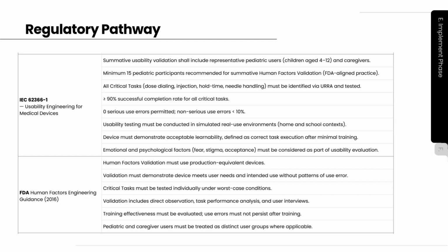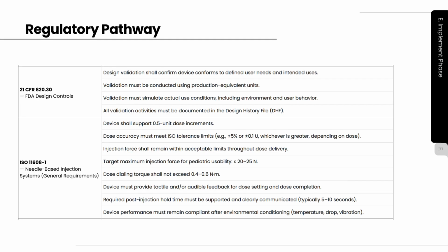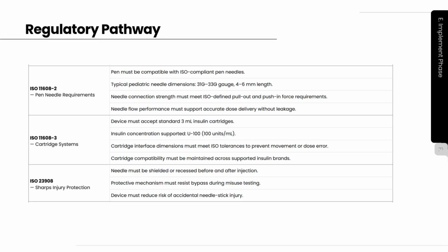IEC 62366-1 for usability engineering of medical devices. The FDA Human Factors Engineering Guidance from 2016. 21 CFR 820.30 for FDA design controls. ISO 11608-1 for needle-based injection systems, general requirements. ISO 11608-2 for pen needle requirements. ISO 11608-3 for cartridge systems.